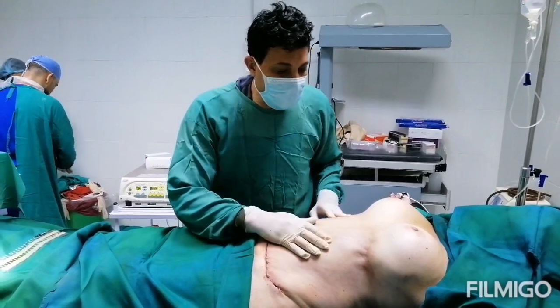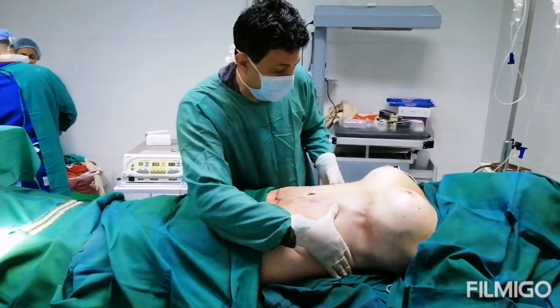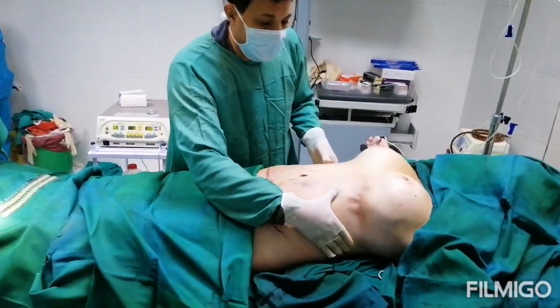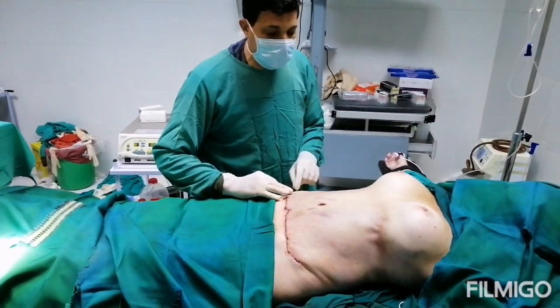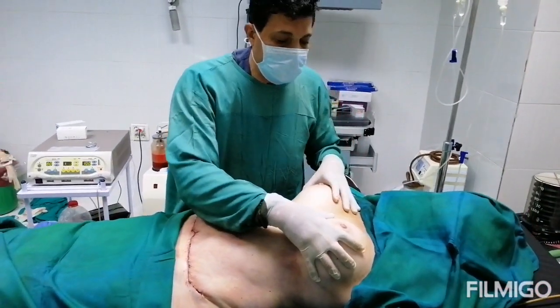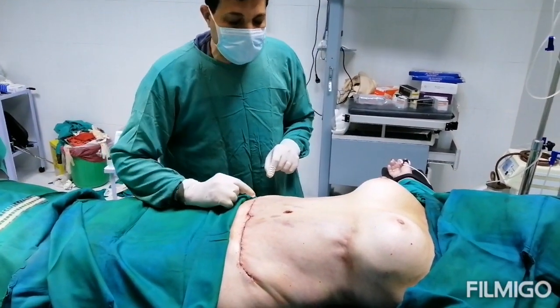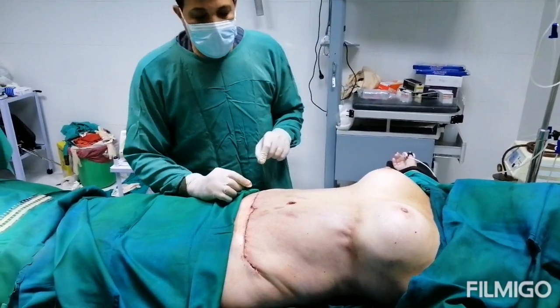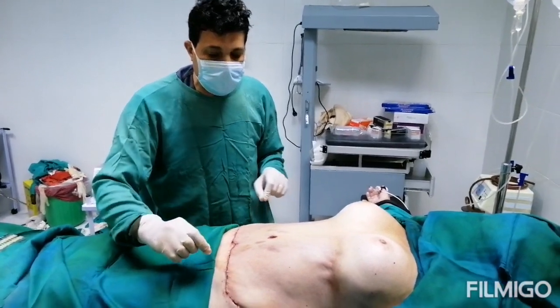Now we have finished the tummy tuck. As you can see, both sides no longer have any excess fat because the liposuction is done. This is the scar of the tummy tuck, and the breast is enlarged by the breast implant. Now we go to close the wound using something called a zip line — meaning closure without sutures. Using this method, it will not leave any marks.